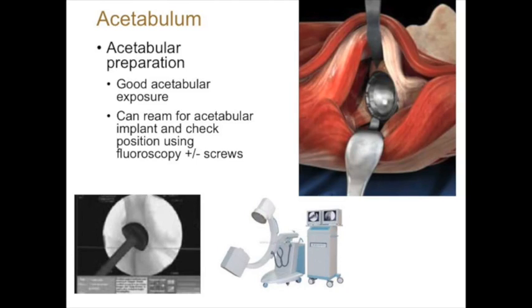After that, the next step is to address the acetabulum. So again, with this approach, we get very good exposure of the acetabulum. We get a really good look at the socket of the hip.